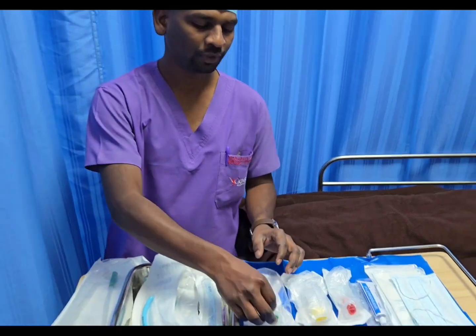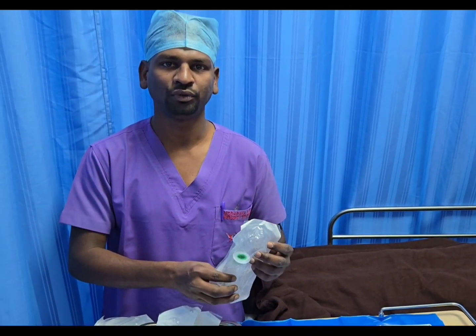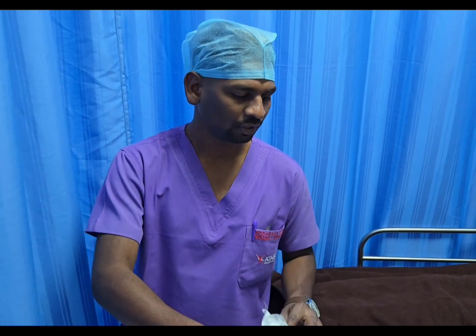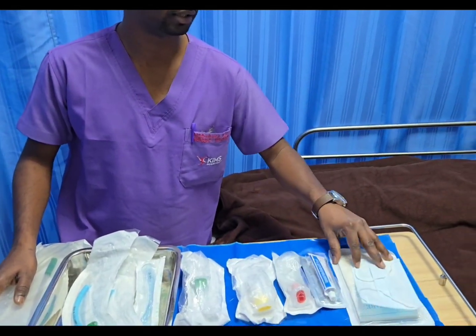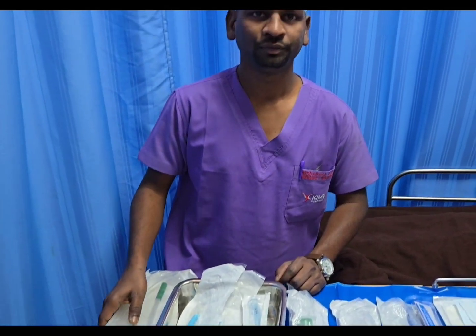For the OPA, the sizes start from 1, 2, 3 up to 4. Size 1 is used for pediatric patients; 2, 3 and 4 are used for adults. We need to arrange the appropriate sizes of OPA and NPA, along with lubricant jelly, surgical gloves, a PPE kit, and a suction operator. These are the things we need when performing the procedure.